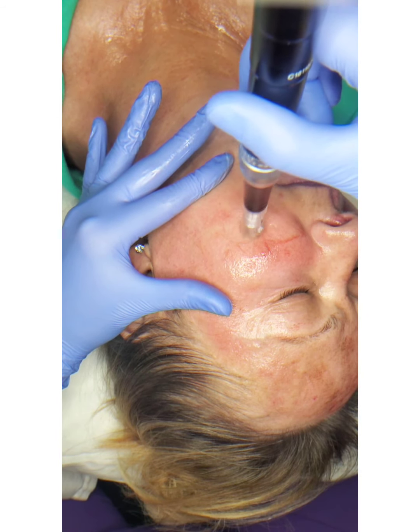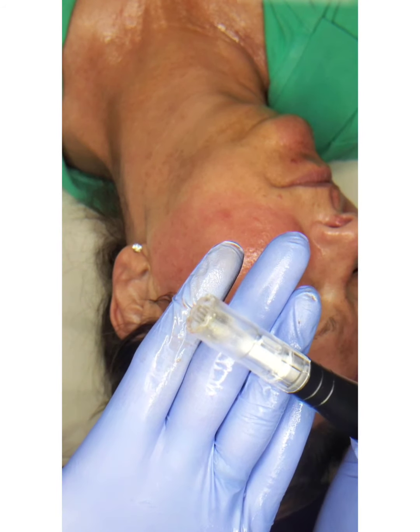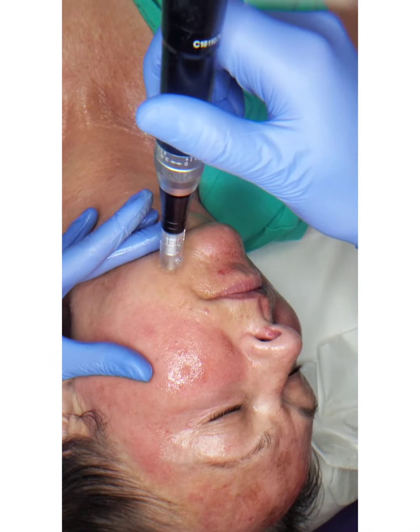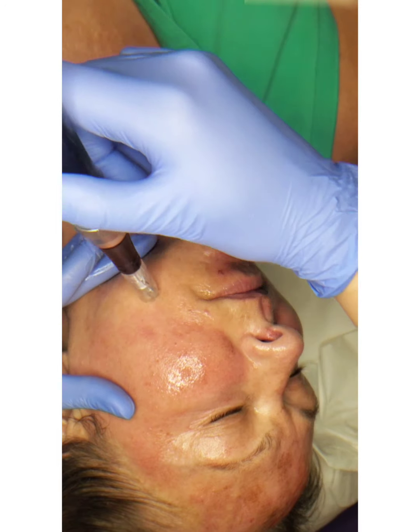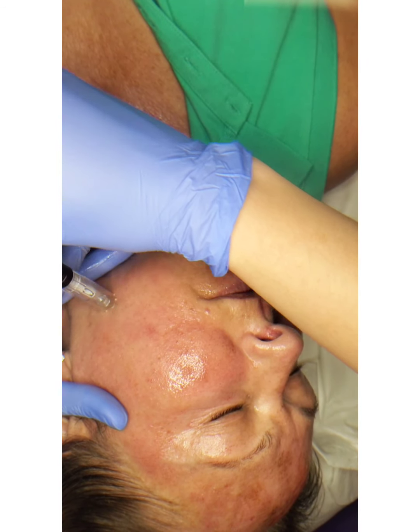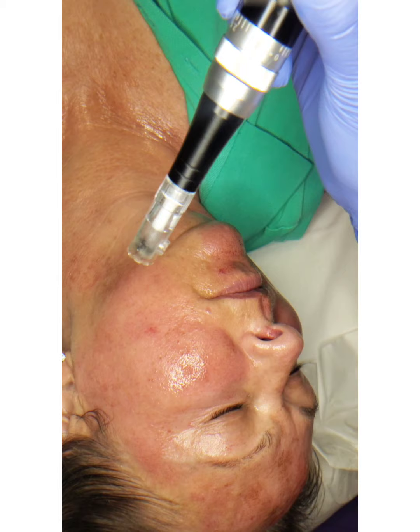So I was really wanting to do a video of at least half of her face and neck, because we'd already done half of her face. See, there's getting to be some blood. You can see that in the video. You can even watch as the skin changes and it goes from her skin color to really pinking up, and then you'll see bits of the pinpoint bleeding coming up, and that's perfect. That's exactly what we want to happen, because that lets me know as the provider that I've reached the dermis. Because if we don't have pinpoint bleeding, not a lot's going on.